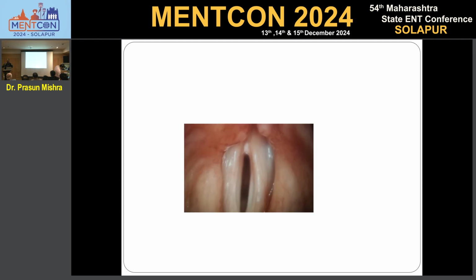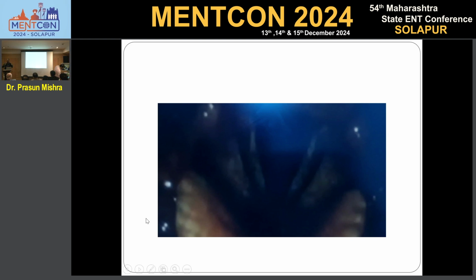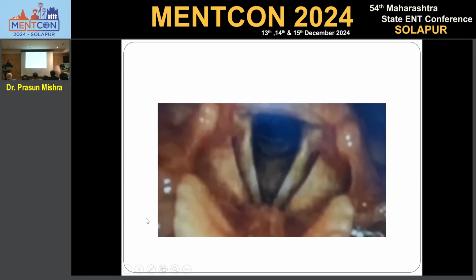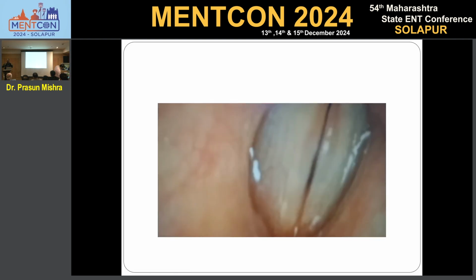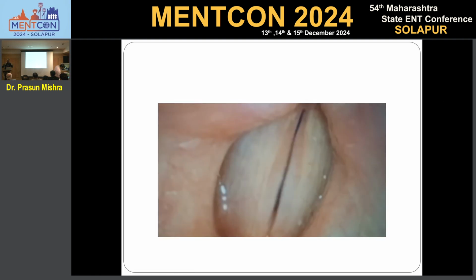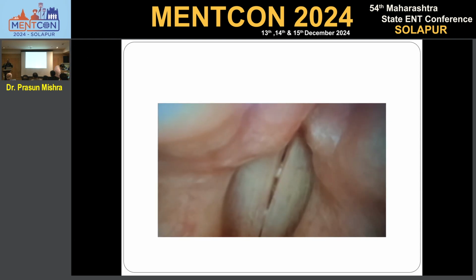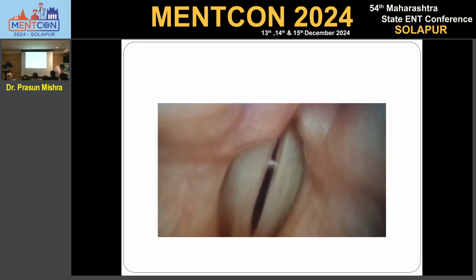If someone is volunteering, the Olympus person will volunteer, right? He wants to sell. You want to do it? Take verbal consent. Yes, do it so that it becomes more of a live demonstration. Do we have time again? We have time, 2 minutes to go.